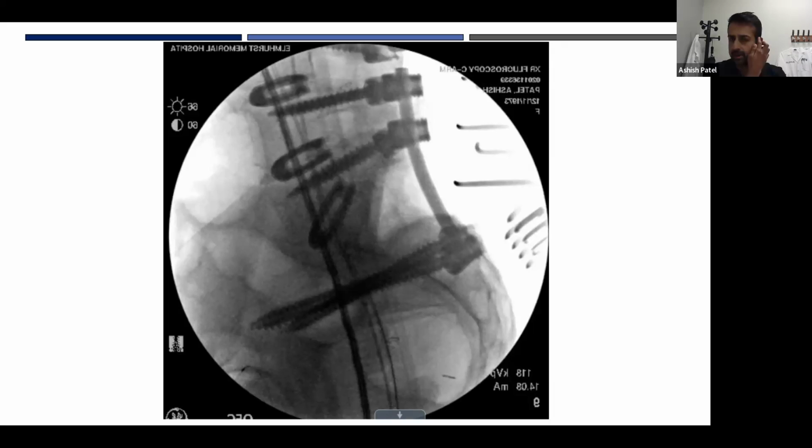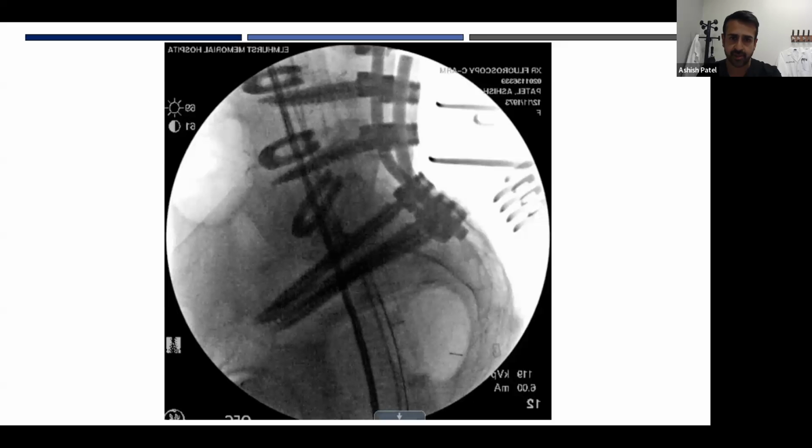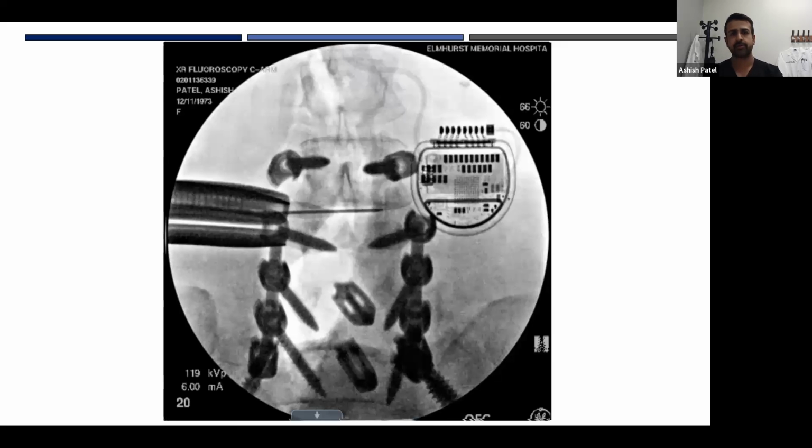I bumped into Chris Ames like a week before doing the surgery, and he gave me his tips on how to stay safe and what to do. I really valued that. And so we created that wedge osteotomy and removed that L5-S1 TLIF, which wasn't fun. That was really sucked in there. We closed down the osteotomy, and once the osteotomy was closed down and we looked at our intra-op films, it looked really good, but that L2-3 disc still looked hyperlordotic.